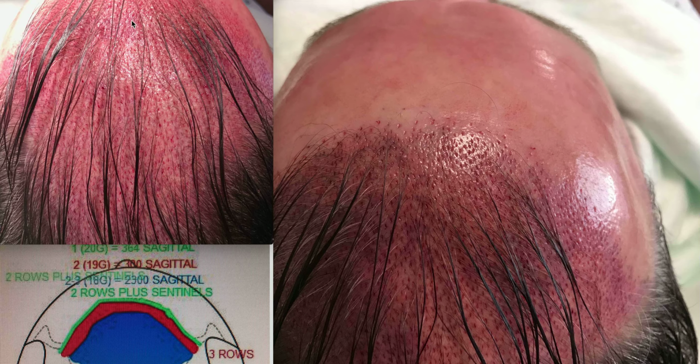So what you're seeing here is that there's a higher density gradient here, and then there's a lesser density gradient here. Even though this is a mega session procedure with about 3,000 grafts, I still want to prioritize this frontal region. And then to define the frontal region in more specificity, this is the central forelock. The central forelock is an area of prime importance.